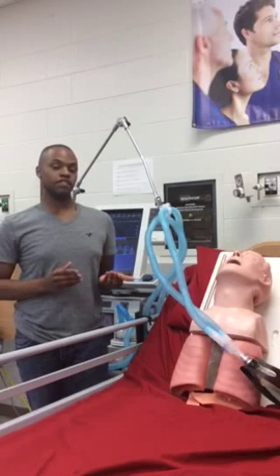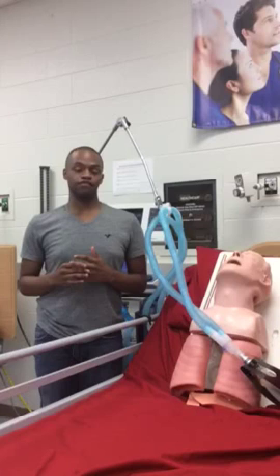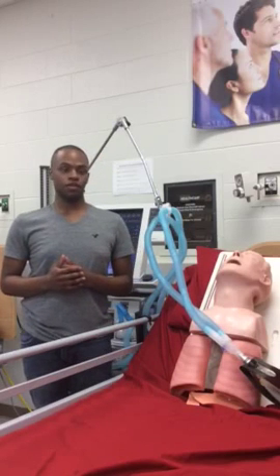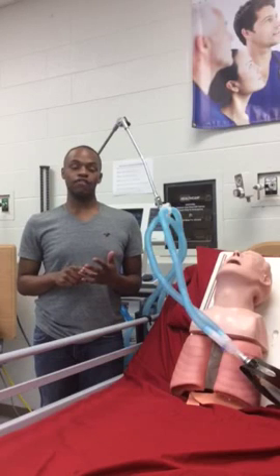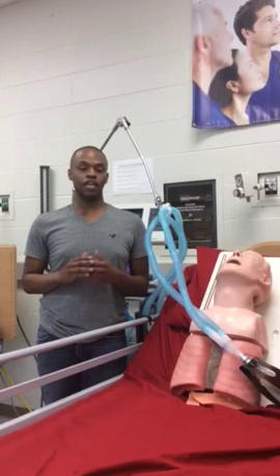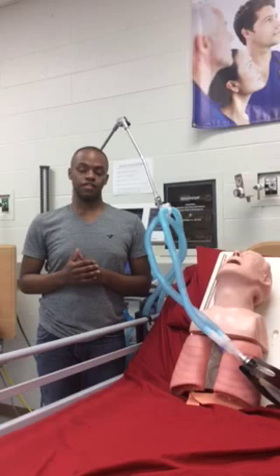Our patient here, Miss Stevens, we're trying to extubate her. But before I extubate her, I want to look at her ventilation and oxygenation status invasively. I can do this because she has an art line in. I can draw blood from that art line and see my numbers and see if I'm happy with them. I can also monitor her ventilation and oxygenation non-invasively by means of capnometry and SpO2. Capnometry will give me a good estimate of where her PaCO2 is, and her SpO2, if I have a good waveform, a good pleth, I can look at those numbers and see where her sats are.